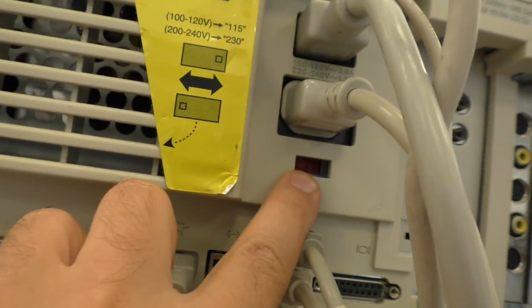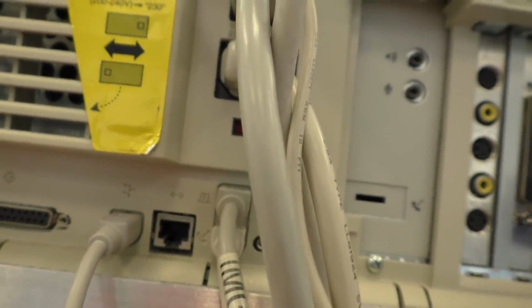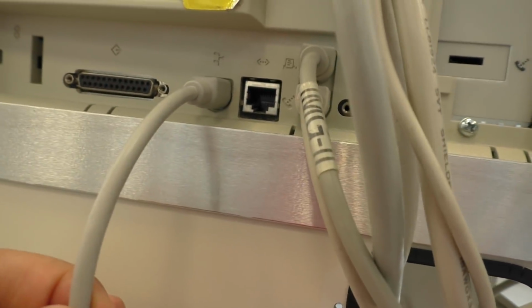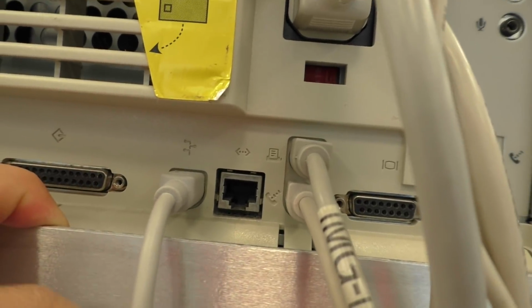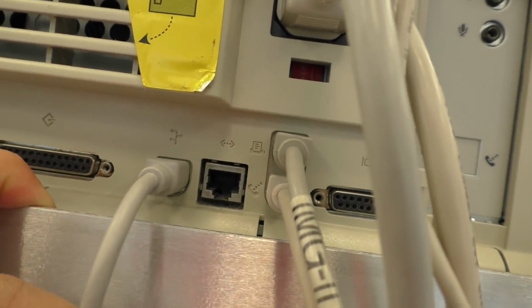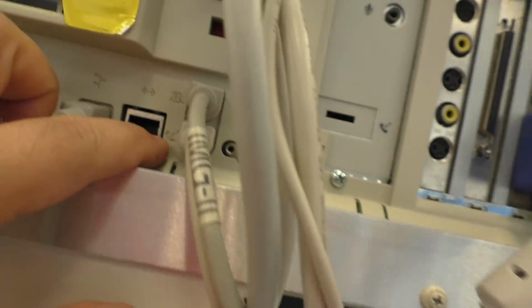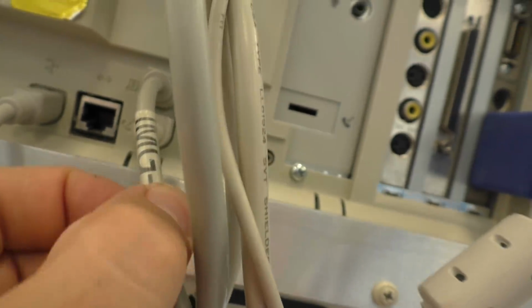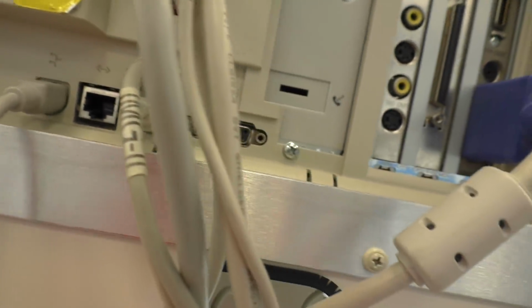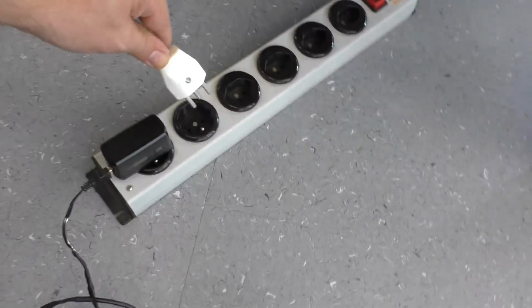That was quite a sensation in those times. There is the switch for 115 to 230 volt, and I set it to 115. That's the Apple Desktop Bus. You can see the logo. That's where keyboard and mouse go in. They share the same cable because it is a bus. We have serial printer and a serial modem. That's where our box below is connected, and the printer cable goes, of course, to the printer through the hole here.